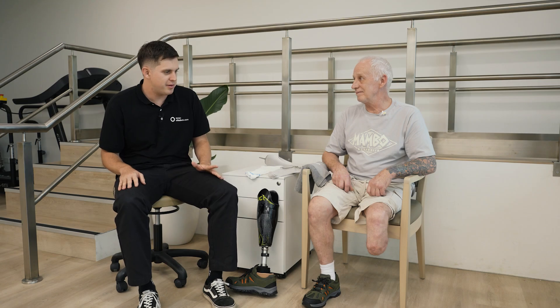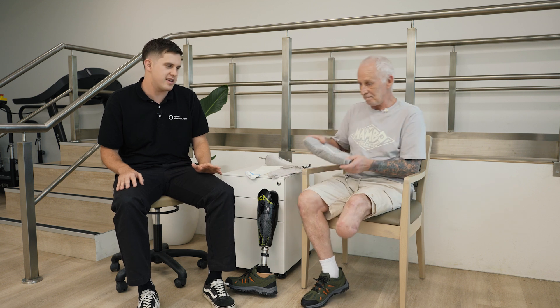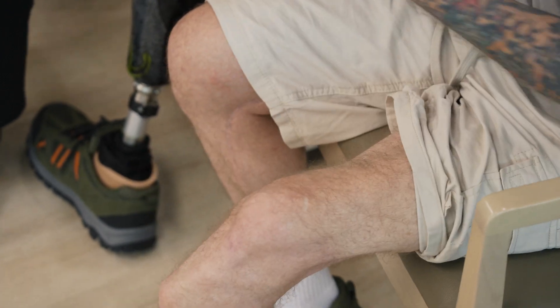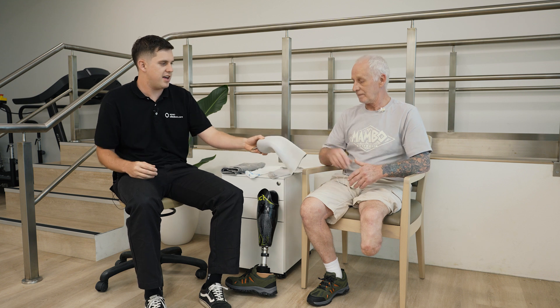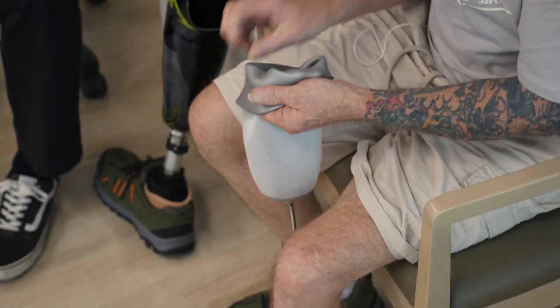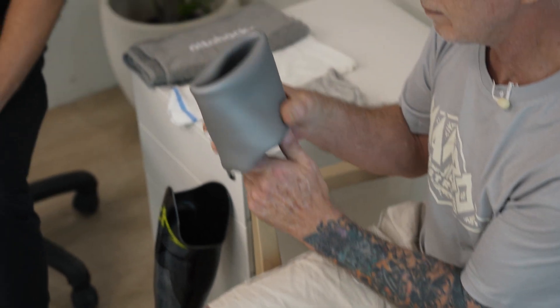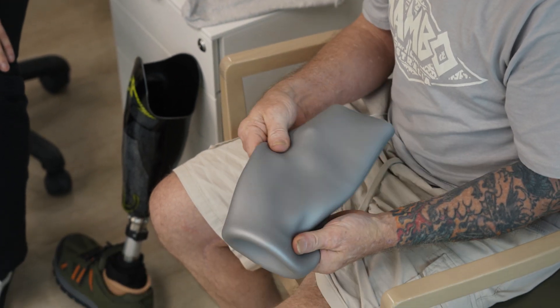So Bill, before we begin, I'm just going to get you to pat down your stump in case there's any residual sweat or water. Bill, it's a good habit to get into inspecting your liner — I'll get you to inspect that for me. What I want you to check for is any damages, cracks, or splits. If there is any damage or crack splits, definitely get in contact with your prosthetist and organize a replacement.